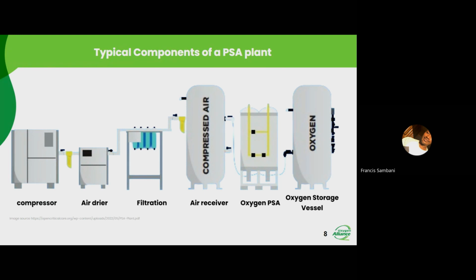So you have the compressor, which compresses your air, and then you have a filter, and then an air dryer. The arrangements are different, honestly, but this is how one would look. The compressor itself would also have an aftercooler inside, and then you have your air dryer, and then your filtration, and then your compressed air. This is how our plant is also arranged. I think this is a better arrangement, because it's better to have clean compressed air.